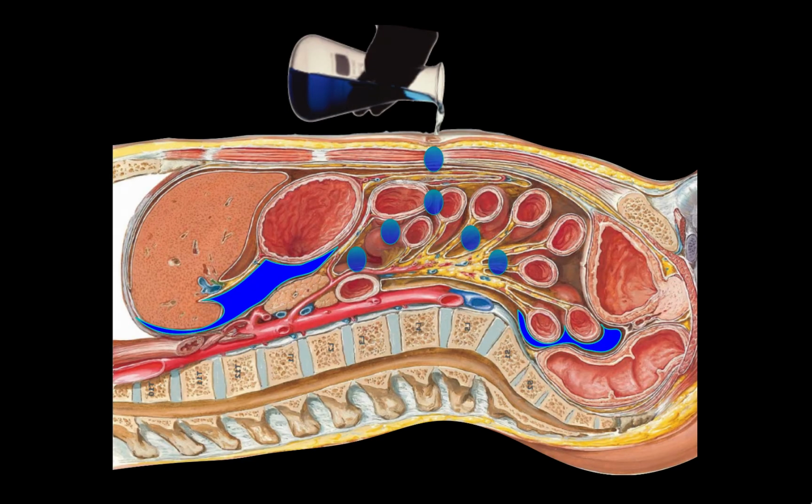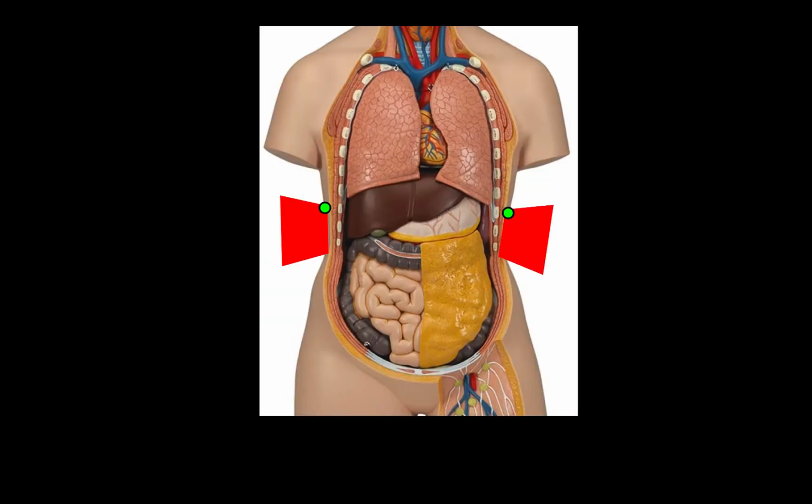In addition to sloshing around in the peritoneal sac, free fluid can also occur in the pleural sac, above the diaphragm, as pleural effusions or hemothorax. The technique for finding this is actually quite easy and does not require much more work if you've already done the abdominal FAST exam and your eyes are attuned to the area above the diaphragm. All you have to do is slide a little bit cranially and look at the dependent portion of the pleural space right by the spine.